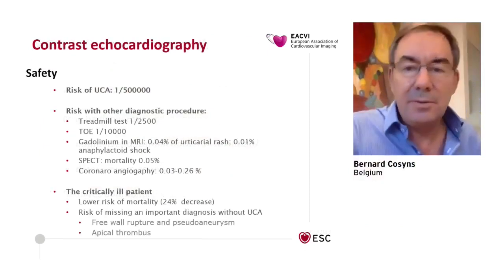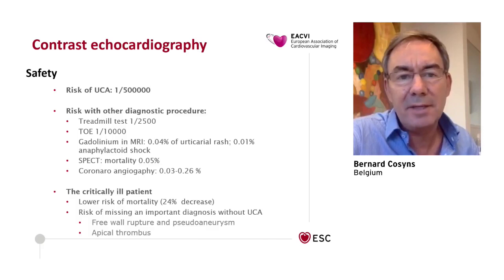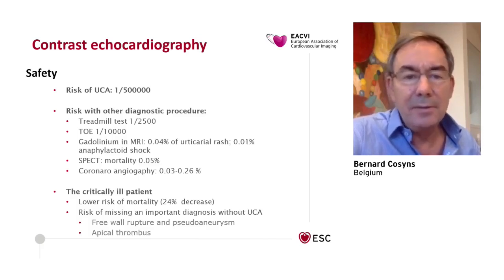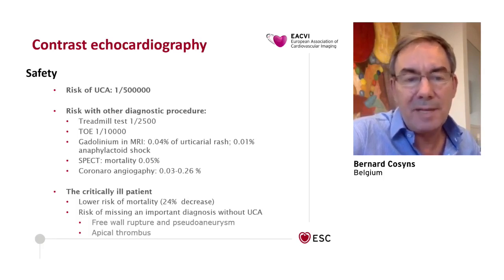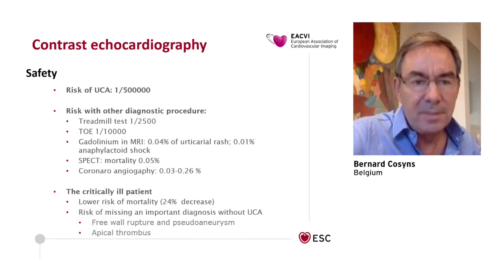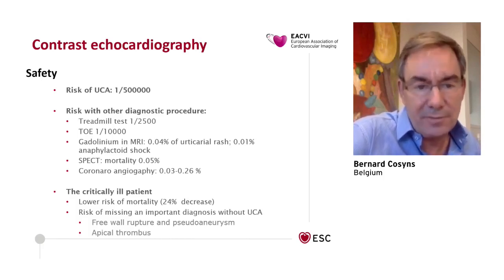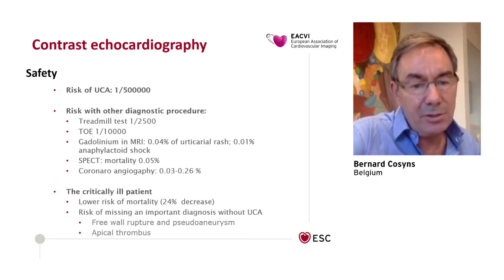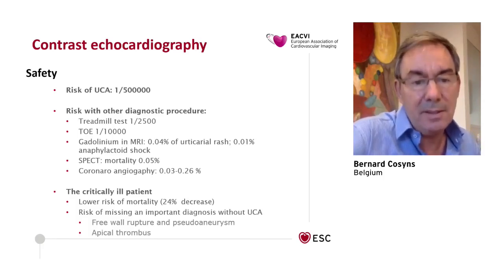And of course, maybe you can remember the black box warning that was raised about the contrast agents for ultrasound in 2007 and 2008, respectively. But as you may know, there were some studies, and I'm pretty sure that Roxy will allude to that in more detail. After these studies, this black box warning regarding contrast echo was removed. Indeed, the risk of adverse events in this population is very low. And if you compare, for example, the risk with other diagnostic procedures like transesophageal echo, it's much lower than transesophageal echo. It's also much lower than coronary angiography. And so we have shown that critically ill patients will have a lower risk of mortality, a 24% decrease, if you use contrast agents in these critically ill patients.